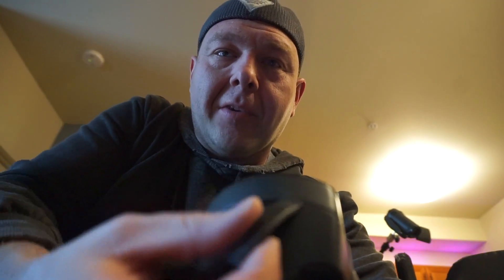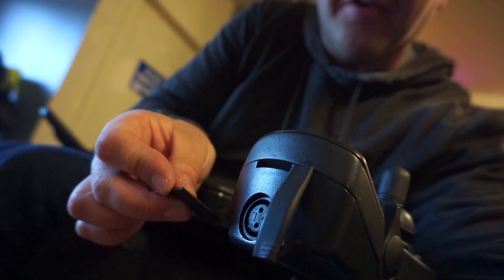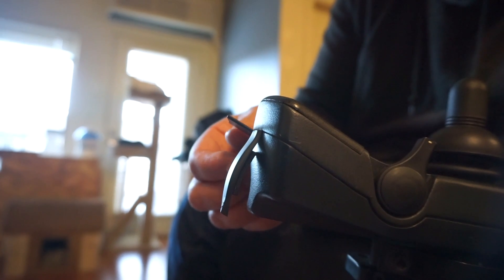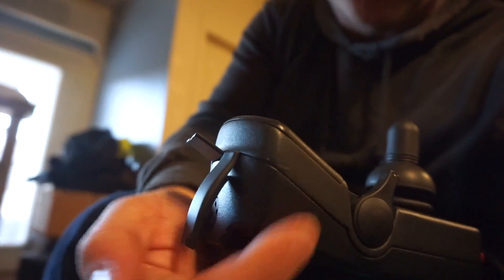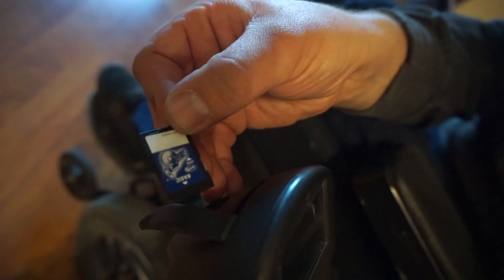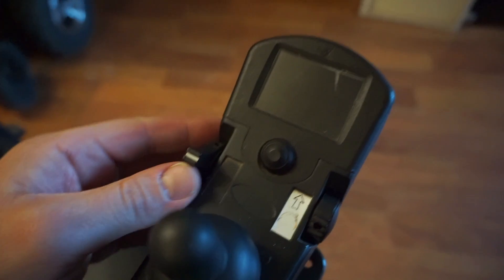To get started, you want to pull the little rubber cover off the front here. The SD card slides in here at an angle — I'm going to turn the chair off. See how the card's kind of facing up a little bit? The angle that it goes in matches the line on the side of this controller. So you just want to put the card in with the label facing up. It'll stick out about this far when it's in there properly. Once you have the card in there, you can go ahead and turn the joystick on.